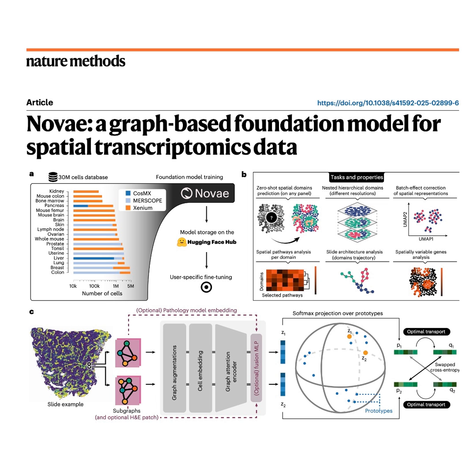So finally, let's talk about the future. Multimodality. Novae can integrate H&E morphological data with transcriptomics. How does it technically achieve that fusion? It's actually really elegant. It brings in a separate pathology foundation model, something like CONCH, to compute visual embeddings from the H&E image patches.